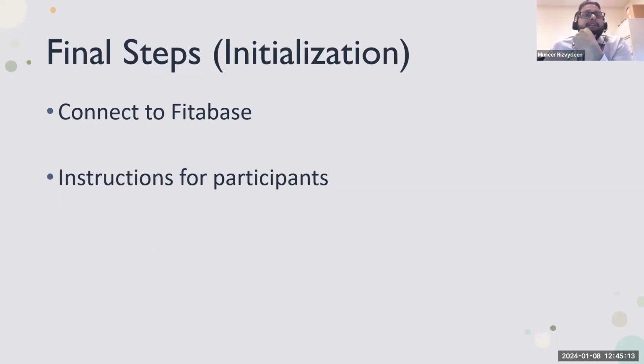Then we connect the device itself to Fitabase, which again, we're happy to provide you with instructions.